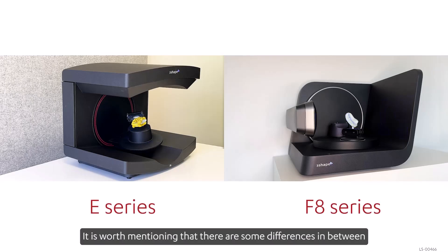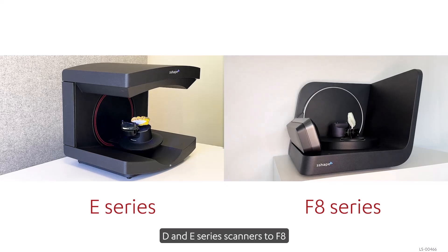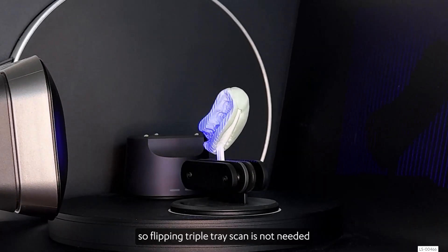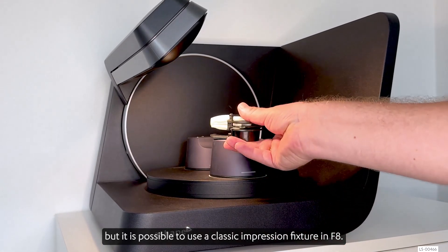It is worth mentioning that there are some differences between D and E series scanners and the F8, as the F8 is equipped with a vertical impression fixture. So flipping the triple tray scan is not needed, but it is possible to use a classic impression fixture in the F8.